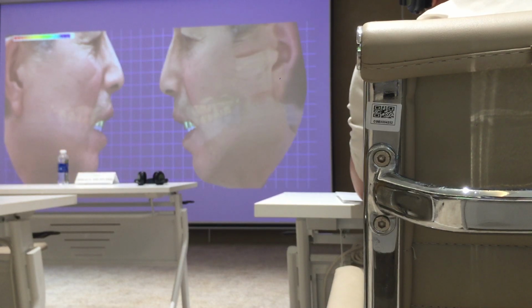And another problem with the facial scanner is that it has its own errors and distortions. The distortion of the facial scanner is inevitable because it goes around the face. And there's an error where the curve is. The face has curves, especially in the canine area and the corner of the lip area.